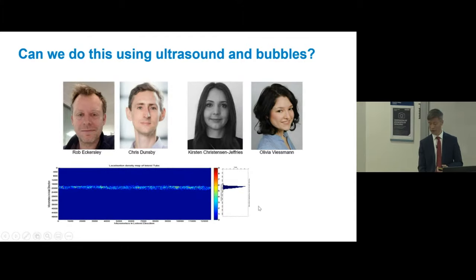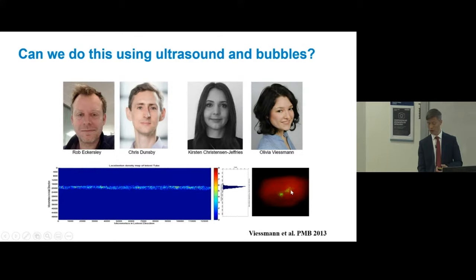And we verified it's the right size. We also show that we can detect two. These are two cross-sections of the tube, very close, where you see the red haze. That is the conventional ultrasound, the diffraction-limited ultrasound. So we are increasing the resolution by quite a lot.